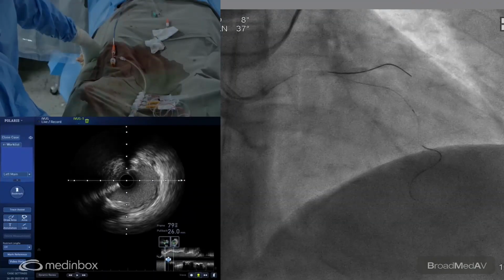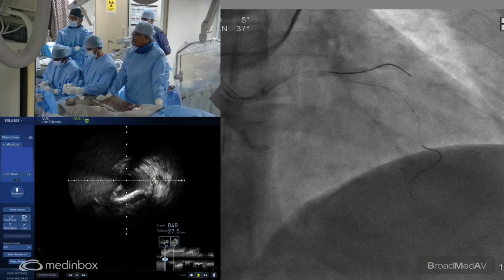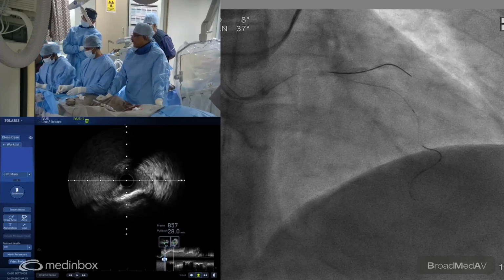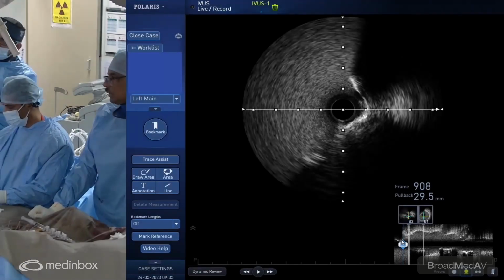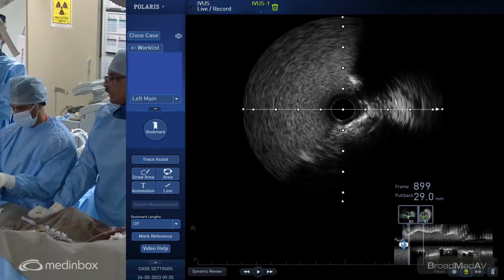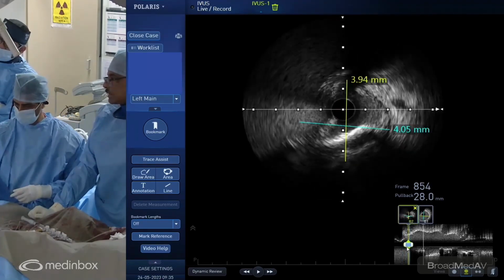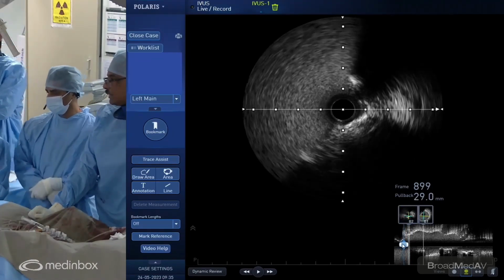Yeah, well, two issues. One is the calcification is significant, but it's not 360. You can see that there is reasonable calcification. So the question is whether we need IVL or we don't need IVL, but it's eccentric hard calcium. With a cutting balloon, we are not going to open that calcium up significantly. And number two, the rotablator will just pass through without even touching that calcium.